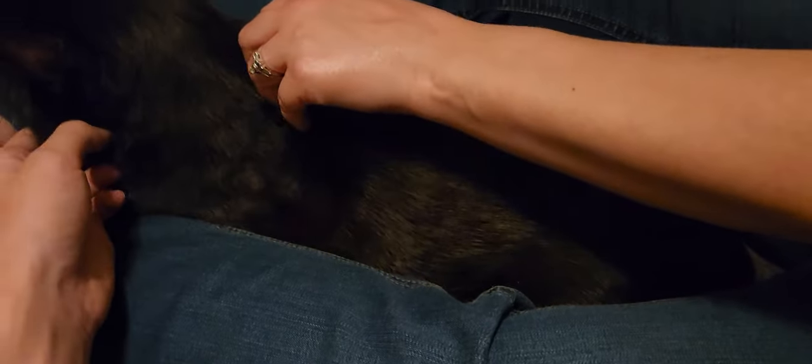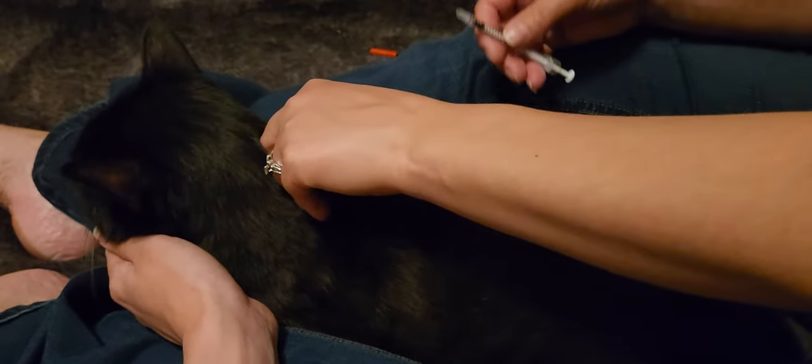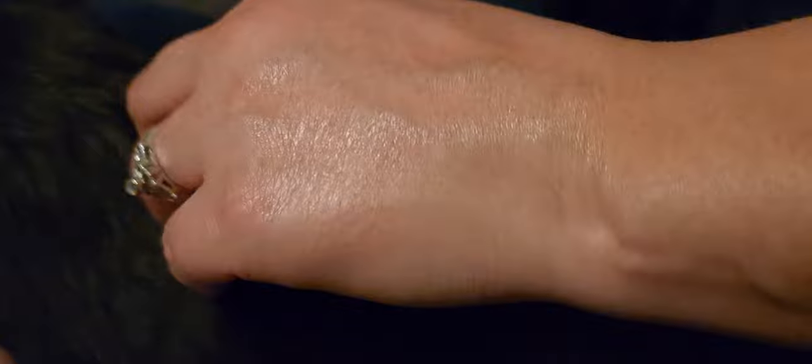So I'm gonna find a spot and I'm gonna pinch a good chunk of skin. My thumb is down here, and underneath my thumb I'm going to give Max the shot. His ears are telling me he's comfortable.